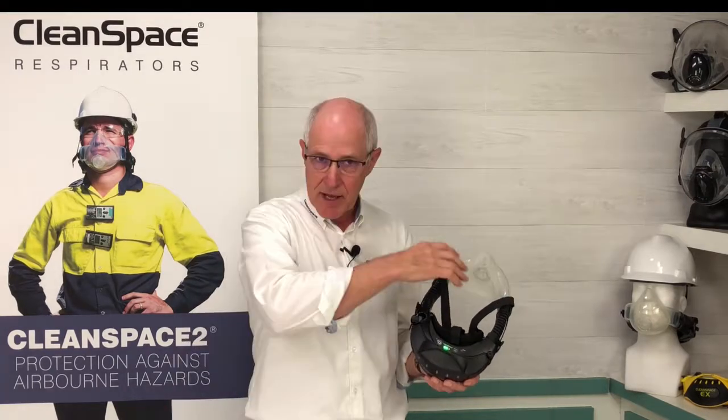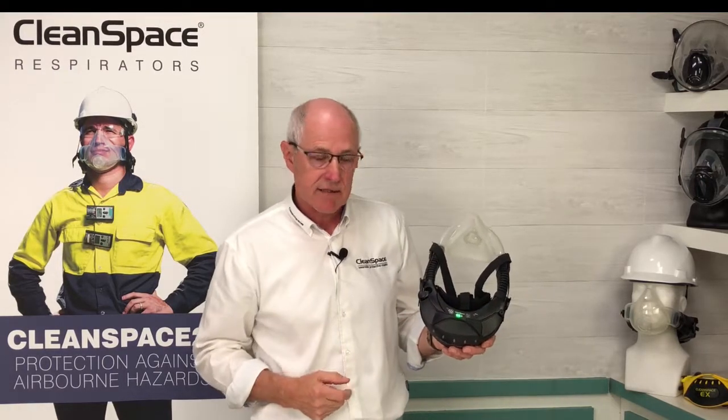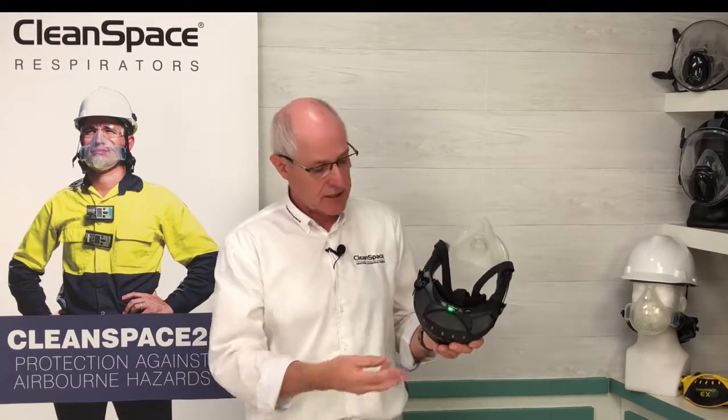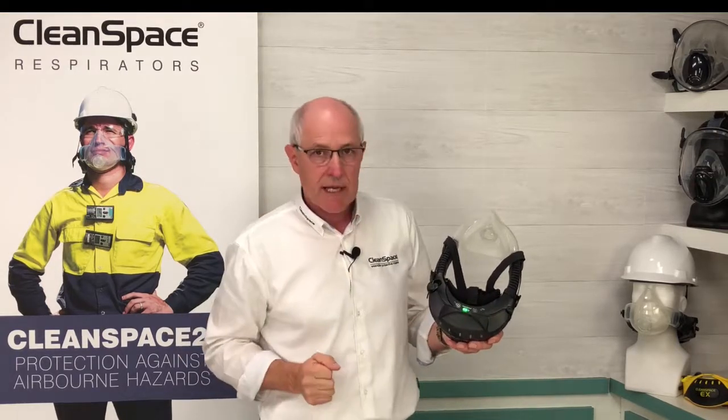If you're working on an important task and the alarm goes off for your filter, you may not necessarily have the ability to come out and change that filter. You've still got 15% of the filter life remaining. If you press and release the on button, it will cancel that audible alarm. Now every 15 minutes until you replace the filter, that alarm is going to kick in again. It's a 75 decibel, it's a double beep, so it's a beep beep. If you hit the on button, it'll cancel the beep. You can continue working, but every 15 minutes it's going to go off.